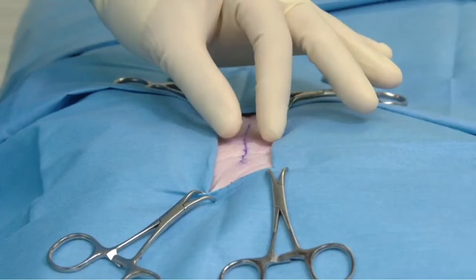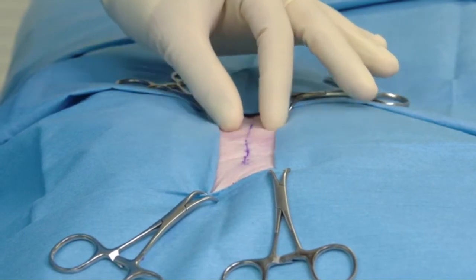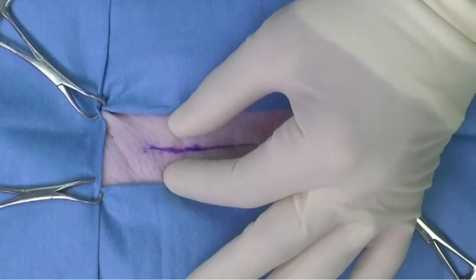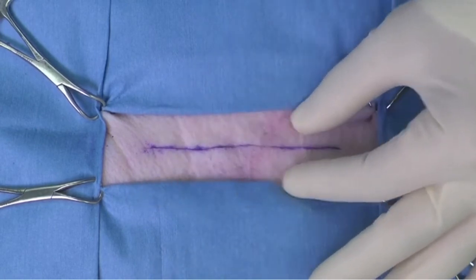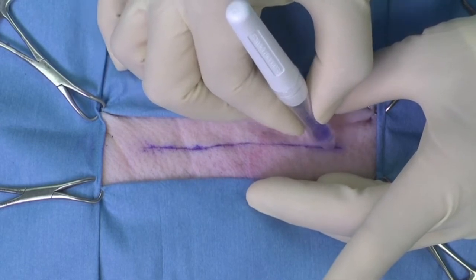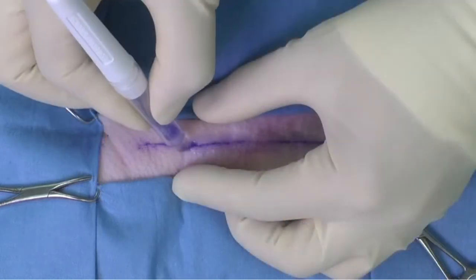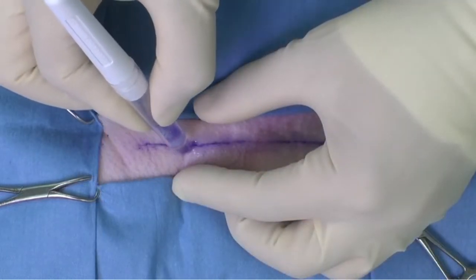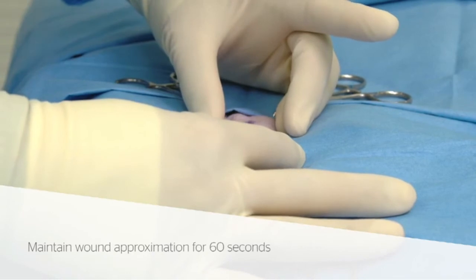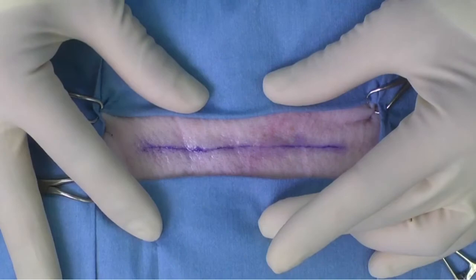Now this video shows it being placed on top of the wound. This is a pig, actually, I think. Yeah, this is like a model pig. See, they're placing it on top of the wound itself, but they're making sure that the wound is actually closed, para lang siyang sure na cover on that wound, para walang mangyaring masama.